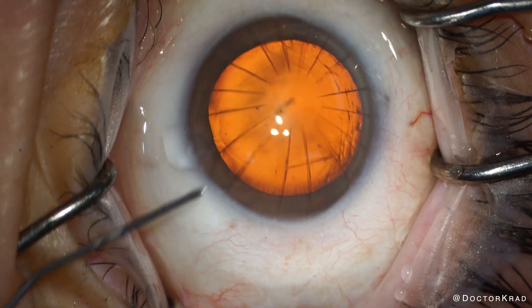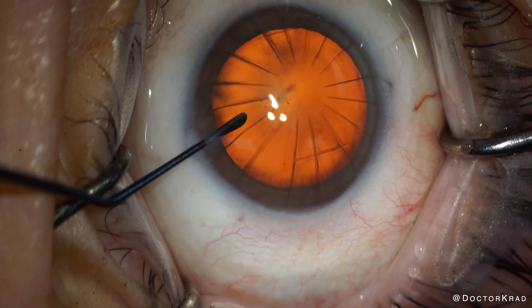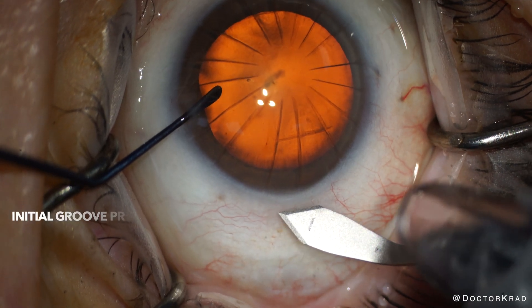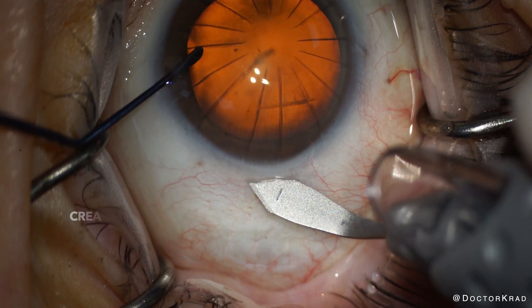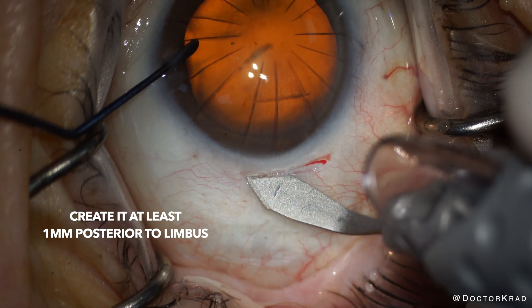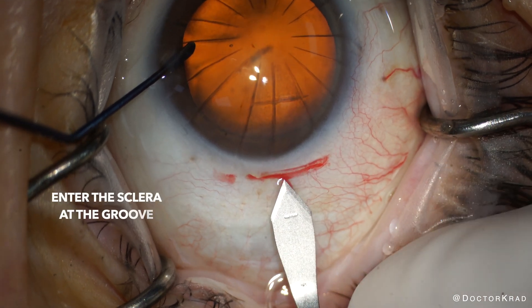With 16 or more RK cuts, you can't fit your main cataract surgery incision in between two of the old RK cuts, so you need to make a scleral incision. You need to start at least a millimeter posterior to the limbus. The way I do it is I create a groove in the conjunctiva and sclera — this will prevent chemosis. Be sure that this groove is a bit wider than your planned incision.